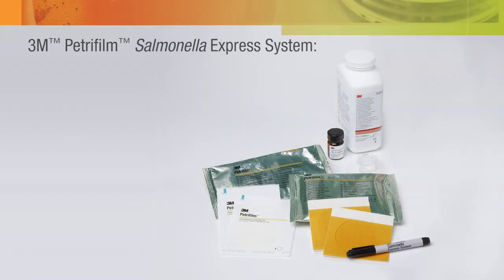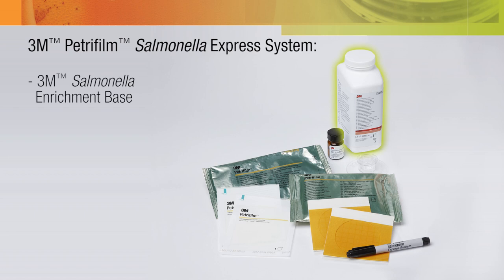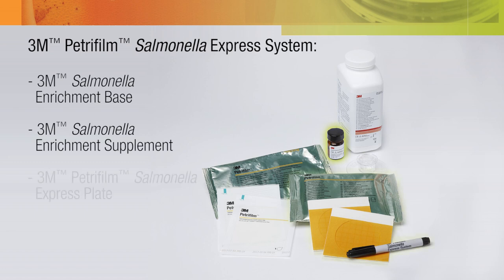The PetriFilm Salmonella Express System consists of 3M Salmonella Enrichment Base and 3M Salmonella Enrichment Supplement, a unique medium for recovery and growth of Salmonella species. 3M PetriFilm Salmonella Express Plate, a sample ready-to-use chromogenic culture medium system that contains a cold water soluble gelling agent and is selective and differential for Salmonella, providing a presumptive result.